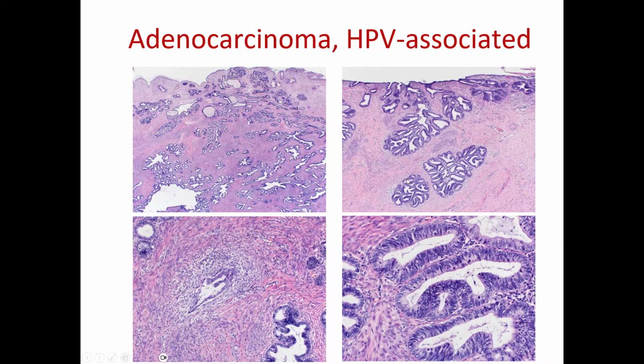So here's the lobular arrangement, here's the diffuse arrangement, and here's individual destructive stromal invasion with individual glands destroying the stroma. You like high power? Here is high power. What do you see here? I see very abnormal cells. Everybody will agree that this is an adenocarcinoma. You have your mitosis, you have your apoptosis. The nuclei are even maybe grade 2 or 3 here.